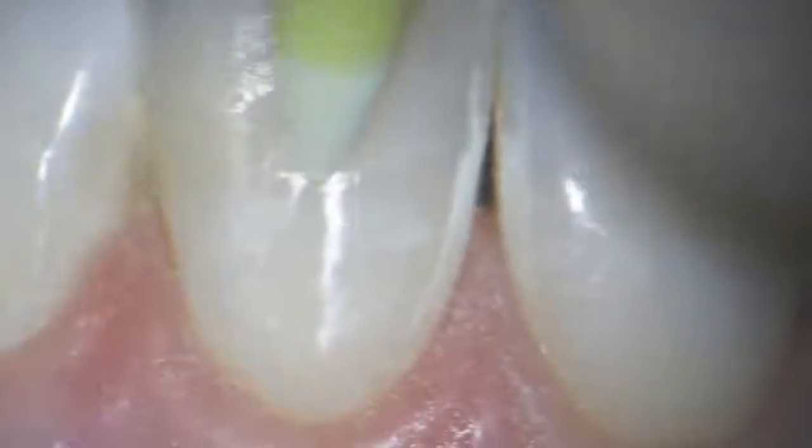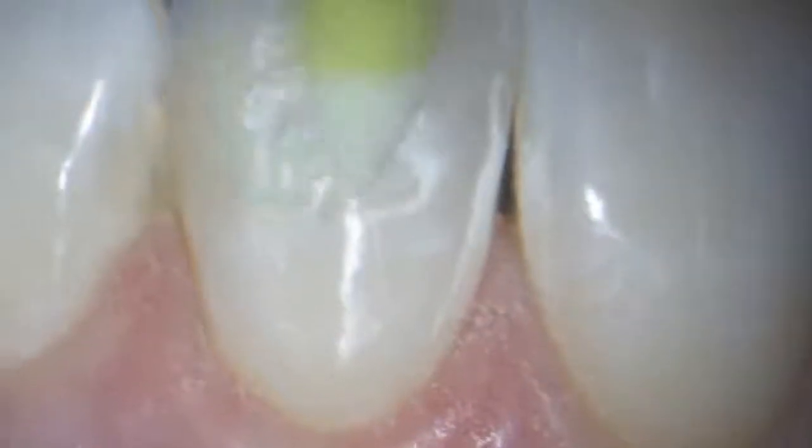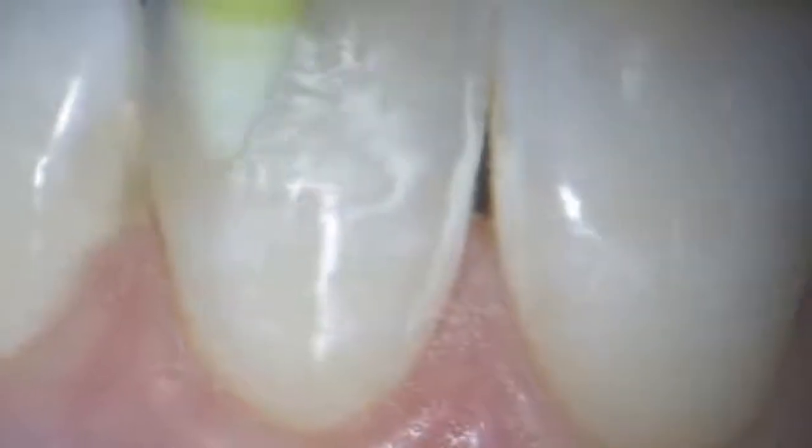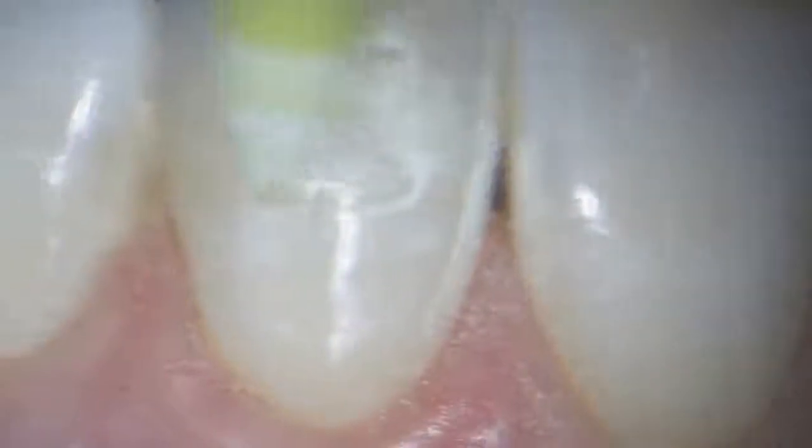It perfectly fits not only to improve the surface, but also for carving very small and thin morphological elements of the tooth surface, for reproducing very thin grooves, V-shaped grooves, for carving very small additional ridges, and so on.